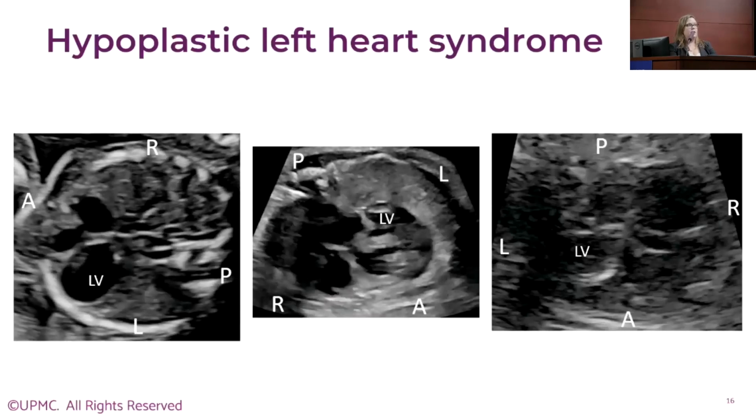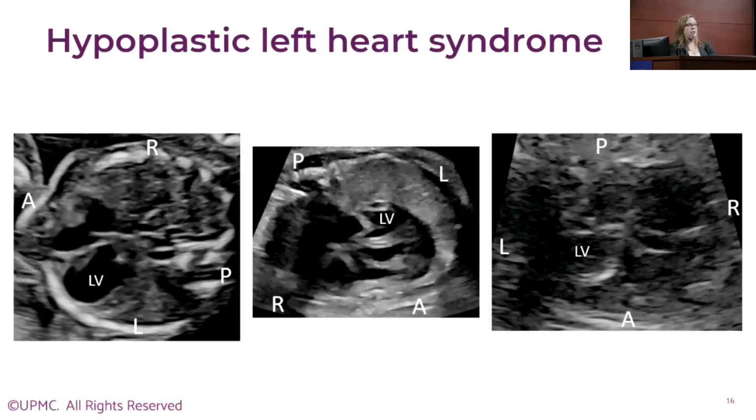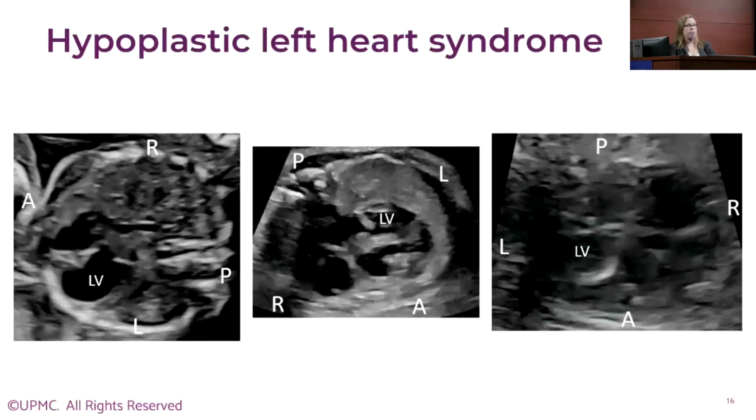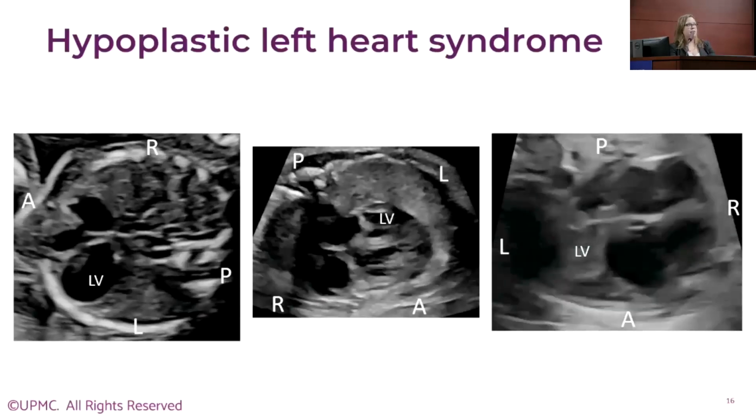and as we saw a few weeks later, that left ventricle had become not dilated at this time, but was starting to become hypoplastic. And as seen in the far right image, the LV is no longer anywhere near apex forming, remains echo bright and poorly contractile.